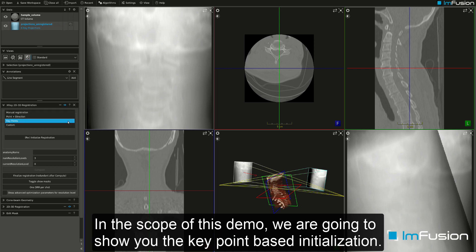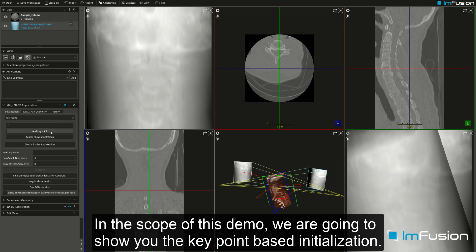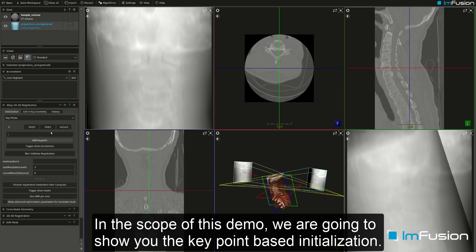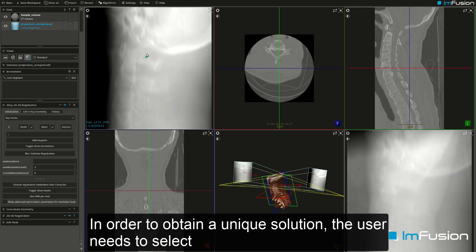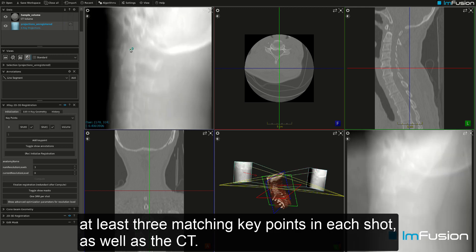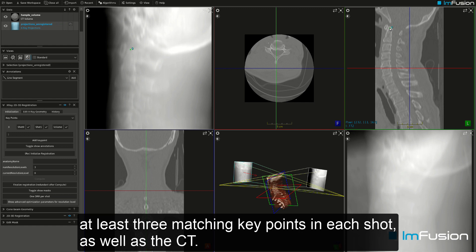In the scope of this demo we are going to show you the key point based initialization. In order to obtain a unique solution, the user needs to select at least three matching key points in each shot as well as the CT.